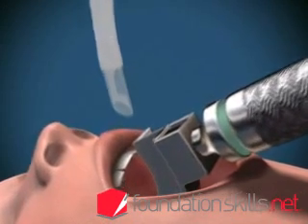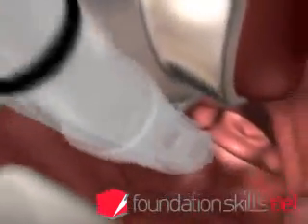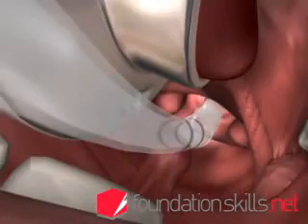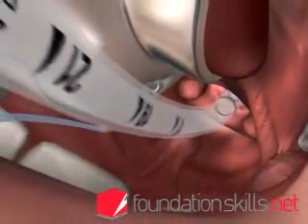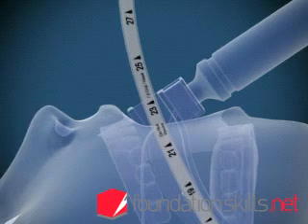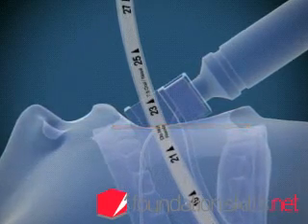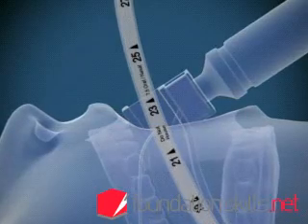With the right hand, insert the endotracheal tube from the right hand side of the mouth directly between the cords and into the trachea until the cuff passes through the cords. The markings on the tube at the incisors will show between 21 and 24 centimeters in the average sized adult when the tube is in position.